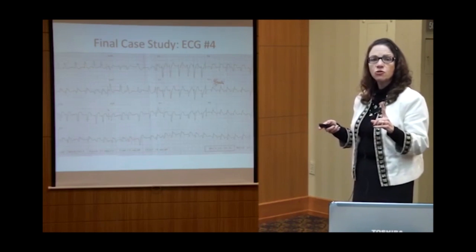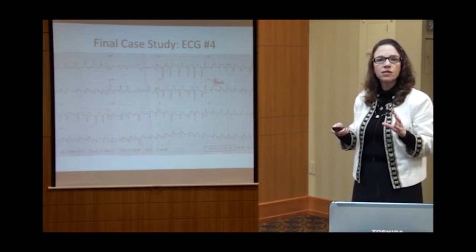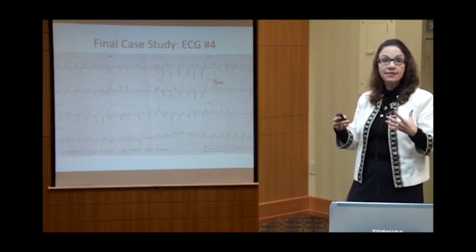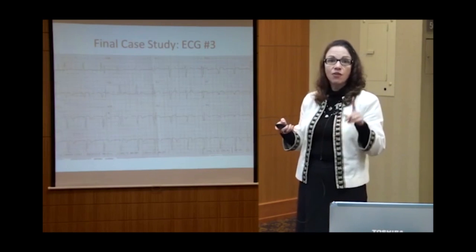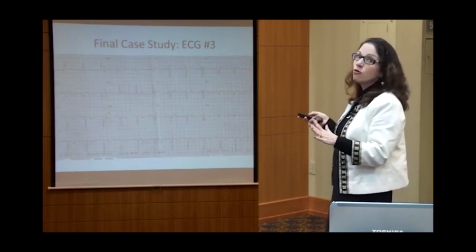Now, what did you learn about T waves today? You learned that once a T wave flips over, it's going to stay flipped over, right? In most patients, weeks to months. And we don't want to prematurely see those T waves come back upright. My rule of thumb in practice is if you flip your T waves over, like he did, they're going to stay flipped over until you're discharged or until I clock out. So, oh, so close, right?